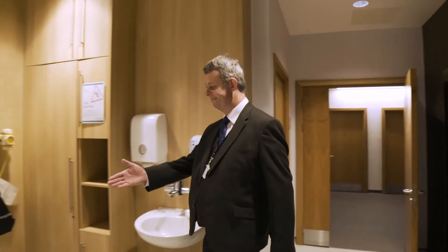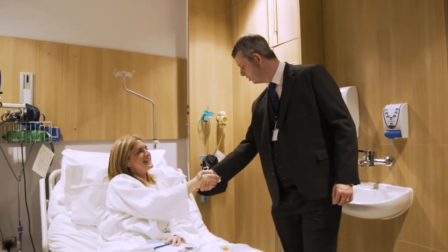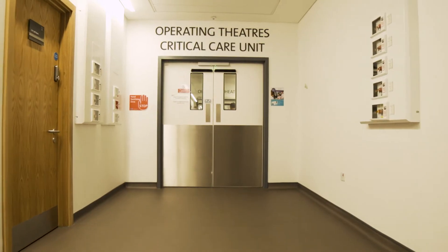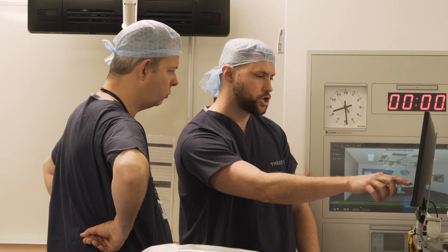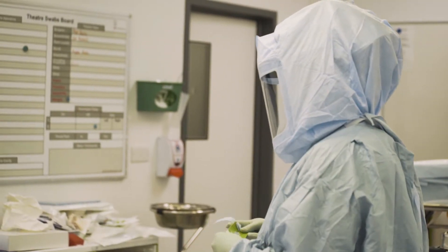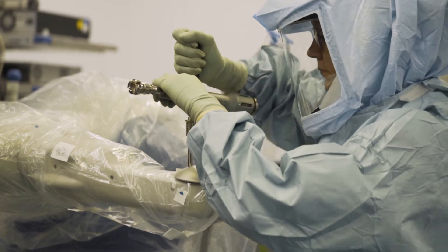On the day of surgery the patient will come into the hospital, we'll go through their operation again and go over the consent once more. Then as they're being prepared for surgery and having their anaesthetic, myself and the Mako technician will go through their pre-operative plan and ensure that we've got the right components and know exactly what we're planning to do.